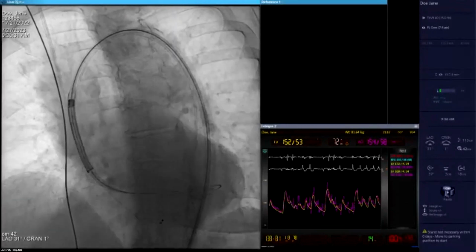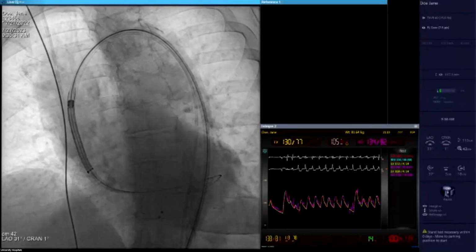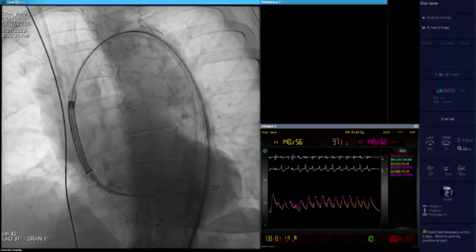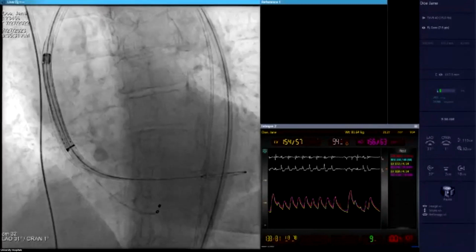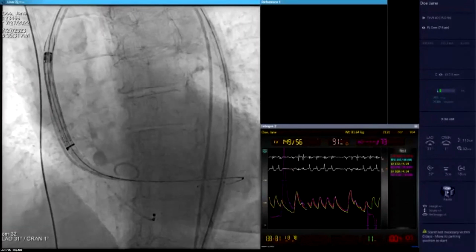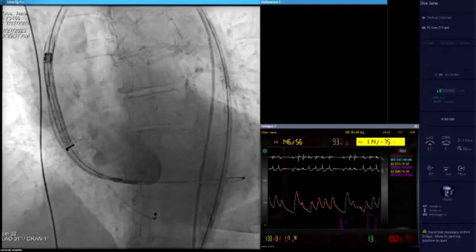And again, after we do, I'm gonna just reduce. Can we bring a little bit more lights in the room, please? I need a little halfway through. It's too dark. Okay. Puff, contrast, Hitesh. Yes. Push a little more. Yeah, yeah. You're close. Just push 1 millimeter. Puff. I think that's good. All right, good. That's good.